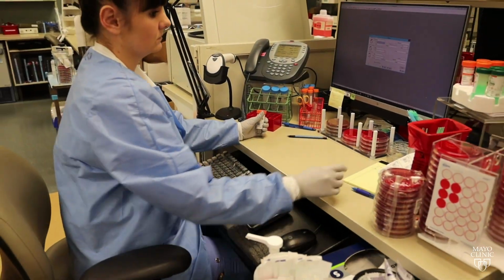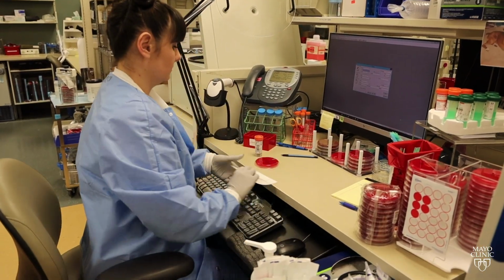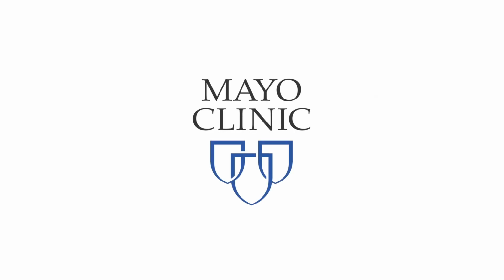I think as an organization, we're doing tremendously well. You talk about man hours that are going into how we can manage this and being prepared. There are so many people at the table working incredible hours to make sure that we are ahead constantly. I've just seen such tremendous teamwork and cooperation and support. But I think what's been so clear in this process is now people sort of know who we are because we're providing this amazing service.